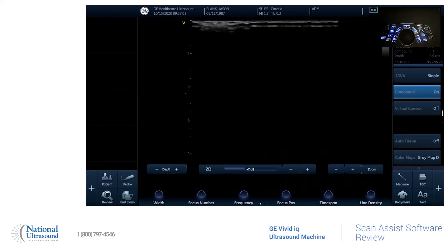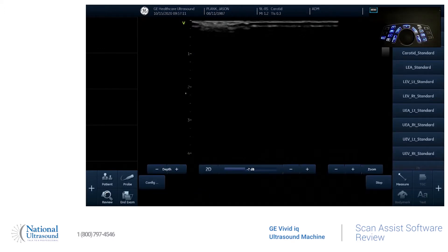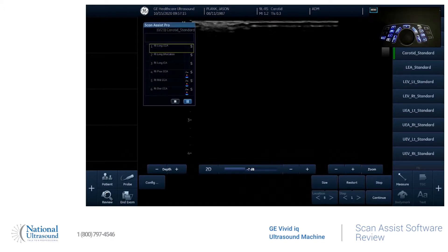So I already have patient information in here. The ScanAssist option, if you go to the plus, it's going to be this icon. And what it is, you can select which option. What it is, is step-by-step instructions of your protocol. So you can customize it to what your actual protocol is, and it just kind of helps you go through each exam.